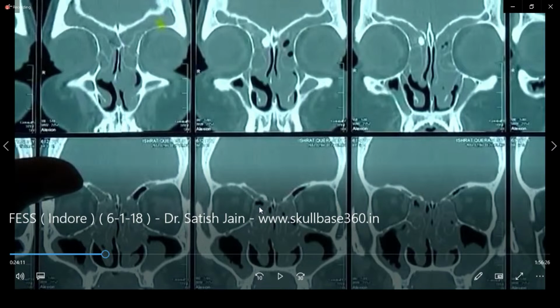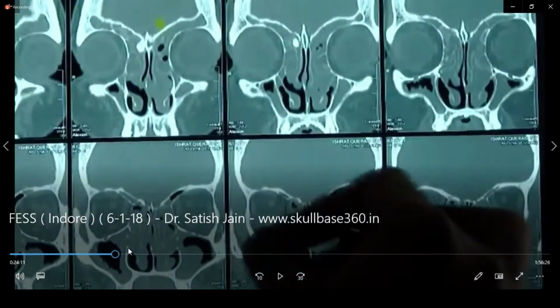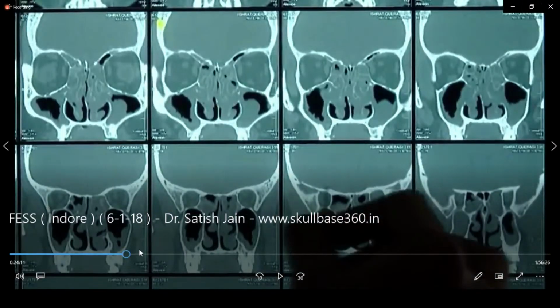And it is posterior to the frontal sinus, posterior to the frontal recess. And now at the level of the cribriform ethmoidal roof, you see this artery passing through the roof into the cribriform lateral lamella. So these are important areas, need to be checked on CT scan as you go behind the thick postethmoidal roof. Now you see the orbital cavity getting narrower and narrower.